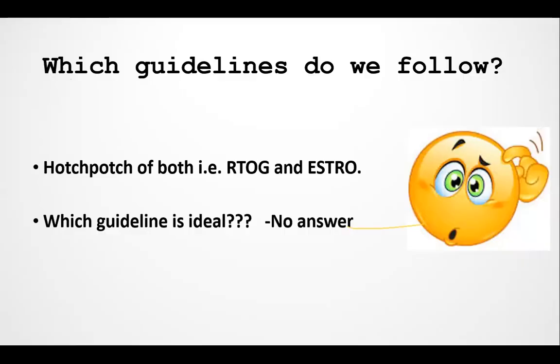We have discussed all the breast, chest wall, and the nodal stations, and we had a comparison between both the guidelines. So which guidelines are ideal? Actually, we don't have any answer for it. Then comes the question: which guidelines should we really follow? Many of the institutes follow a combination of both RTOG and ESTRO. Even we follow the same. It is a combination of both RTOG and ESTRO guidelines.